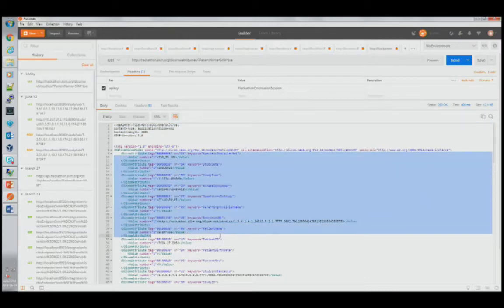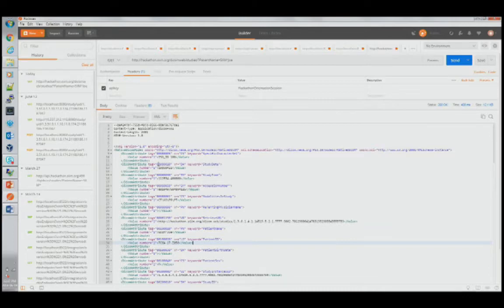You'll see a lot of attributes. Each attribute has a tag. That's what Brad mentioned. It's a hexadecimal identifier of the attribute. I know it looks scary, but it's there for a reason, because DICOM is very much backwards compatible. So in theory, you could crack open a DICOM file that was created 20 years ago, and you should still be able to consume it today. And you should also be able to transform it into this format, because that's another stark difference between HL7 and DICOM. V2 and FHIR are a revolution. It was completely reimagined from the ground up, whereas DICOM web is an evolution. It builds on top of existing DICOM, brings it to the 21st century, but does not necessarily rebuild everything from scratch.